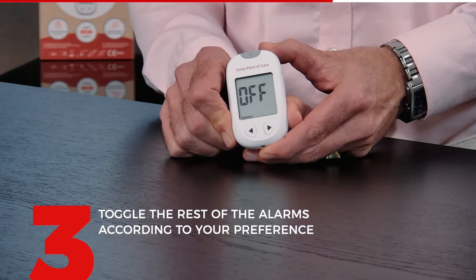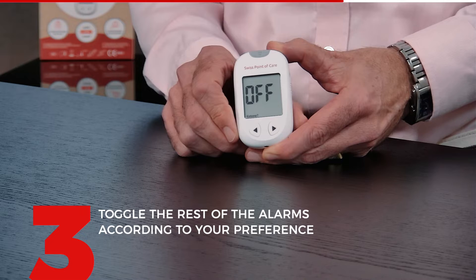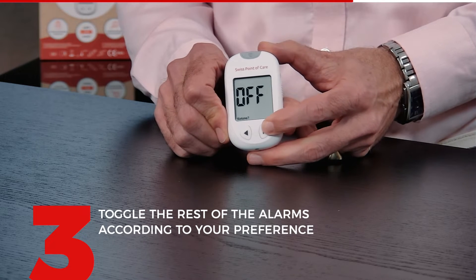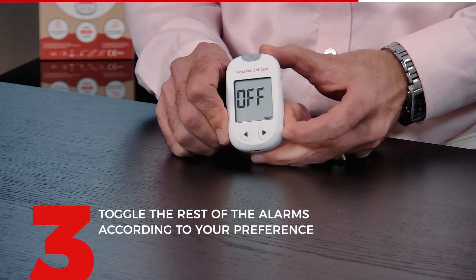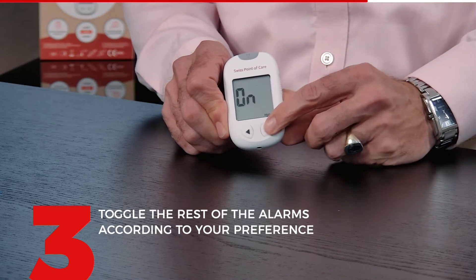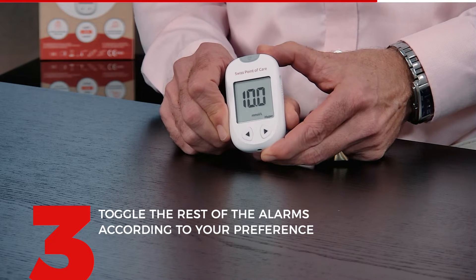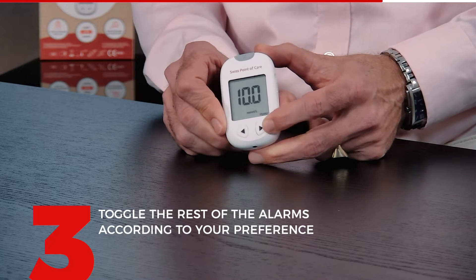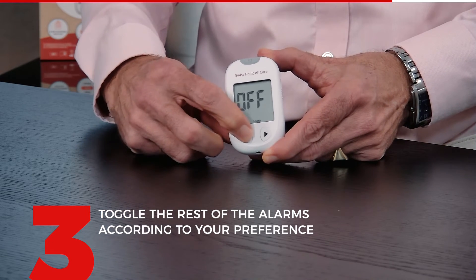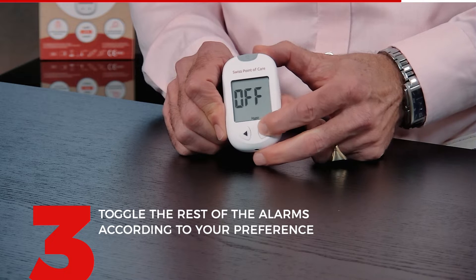The next thing is do you want a warning if your ketone levels are maybe too high. For most people this is off, but depending on what your diabetes doctor says you might want to put this on. For now we will leave it off. The next thing is two warnings — the first one is a hyper warning. You can turn it off or on; I will put it on. Press the right-hand side to confirm. You can set which value you want the hyper to be alarming you at — I'm just going to leave this as default. For the hypo, in this case I will leave it off, but if you want to turn it on you press it here. Press here to confirm.